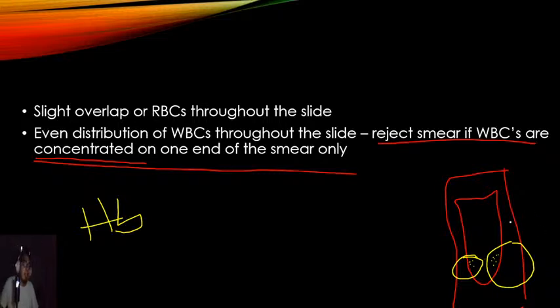Okay, so it might be that the sample was taken from a capillary blood sample, or the sample was hemoconcentrated, and that the cells were pushed out of the vein, the capillaries, and resulted in an uneven distribution of the cells.